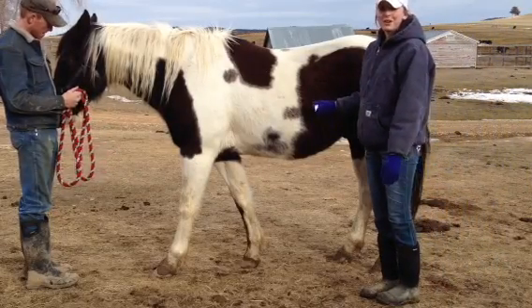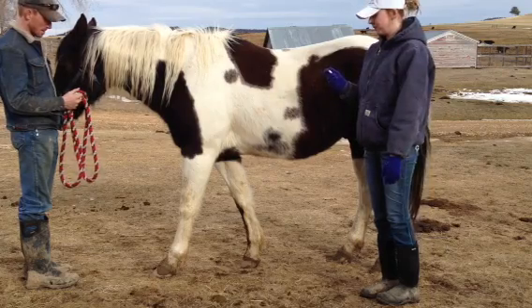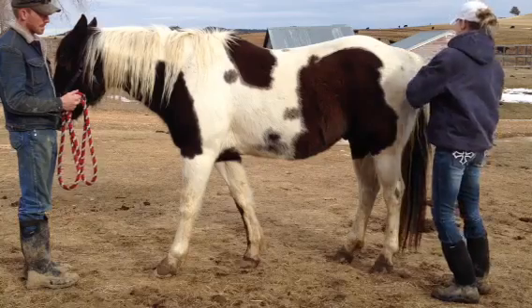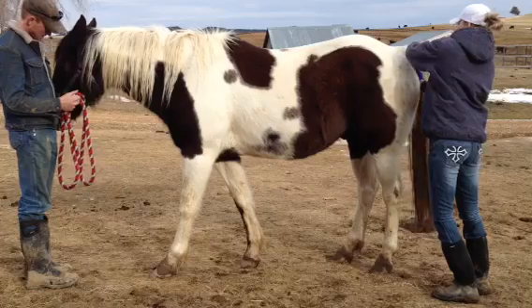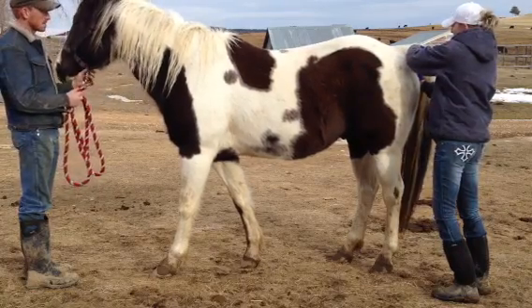Hi, my name is Ryan Goodman and I'm going to show you how to take vitals. The first vital I'm going to show you how to take is the temperature. What you're going to want to do is take the thermometer, lift up their tail, and stick it in their anus and leave it for about a minute or so.